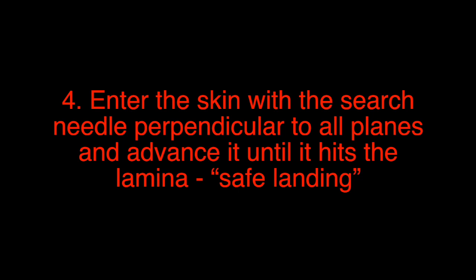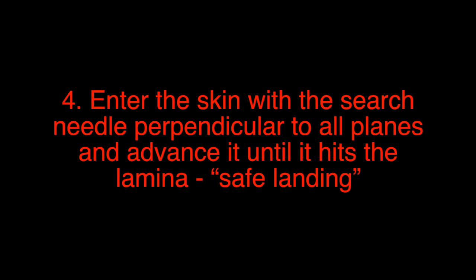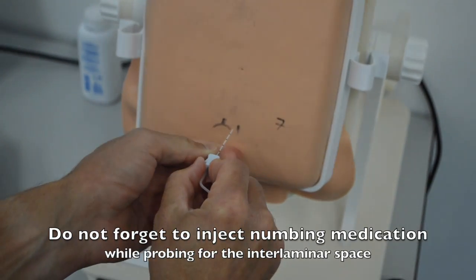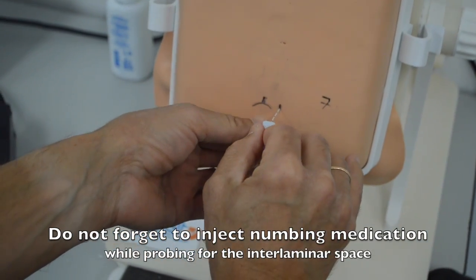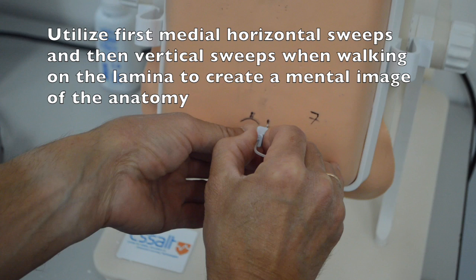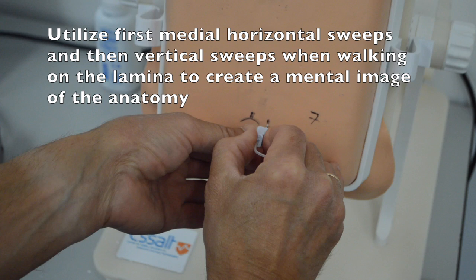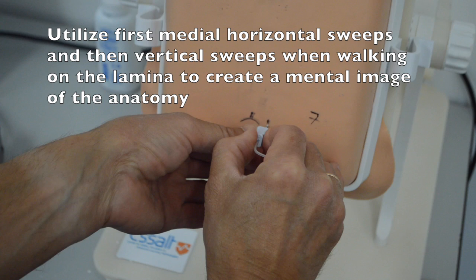Step 4. Enter the skin with the search needle perpendicular to all planes and advance it until it hits the lamina, also known as safe landing. Do not forget to inject numbing medication while probing for the interlaminar space. Make sure to utilize first medial horizontal sweeps and then vertical sweeps when walking on the lamina to create a mental image of the anatomy.